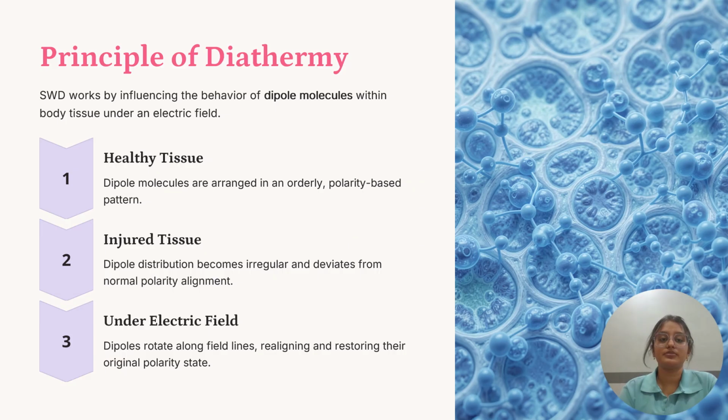So, principles of diathermy. SWD works on the behavior of the dipole molecules present within the body tissues under an electric field. In healthy tissues, these dipole molecules are arranged in an orderly, polarity-based pattern. In injured tissues, the dipole distribution is irregular and deviates from its original polarity-based alignment. Under the influence of the electric field, the dipoles rotate along the field lines, realigning and restoring their normal polarity state.